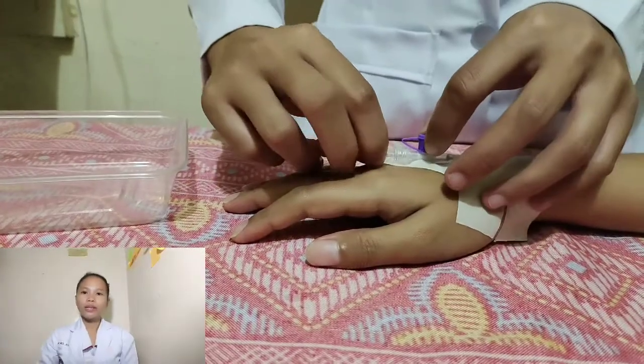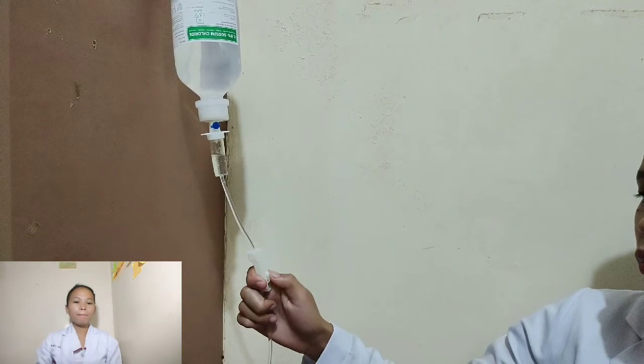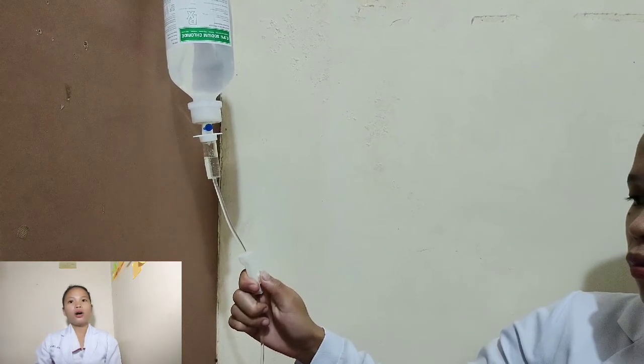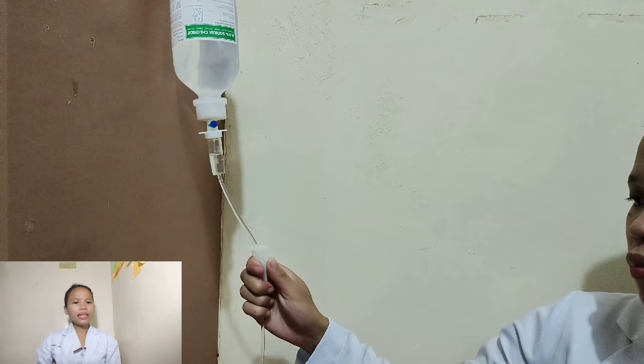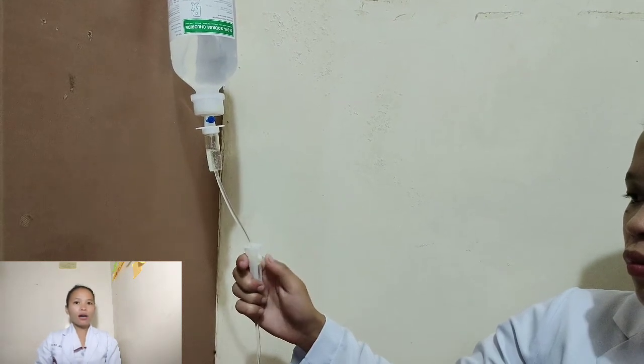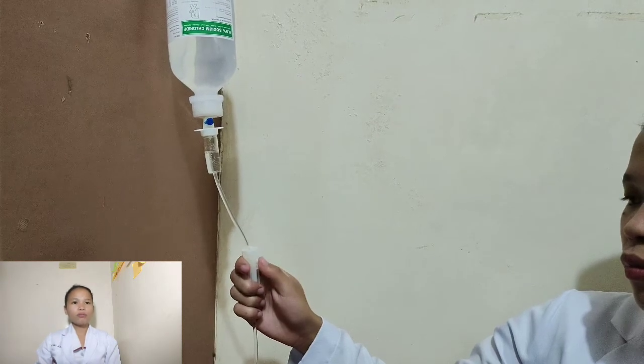Connect the tubing to the needle. Start the flow of solution promptly by releasing the clamp on the tubing. Examine the site for signs of infiltration. If IV flow is not maintained, the needle is accidentally slipped out of the vein, and solution will accumulate and infiltrate into the surrounding tissue.